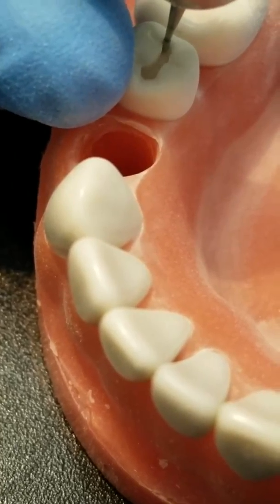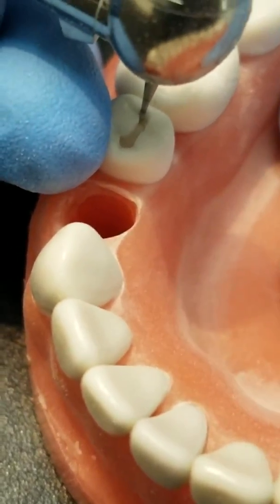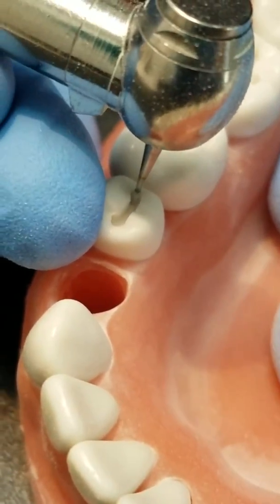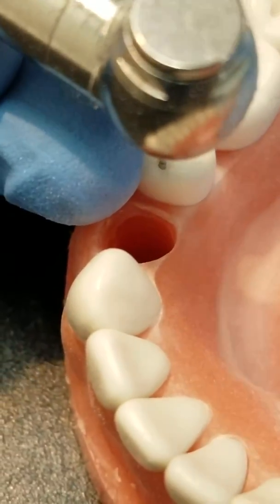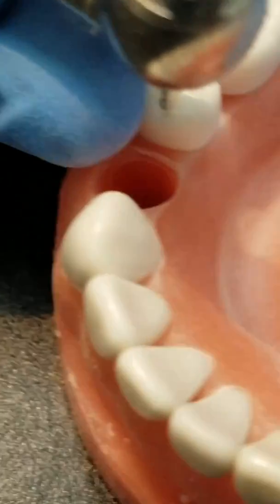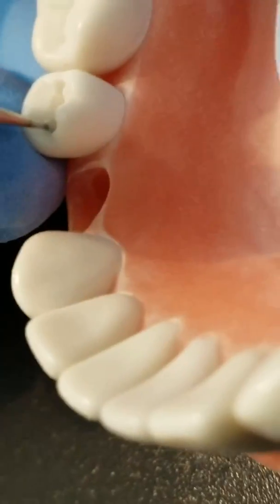You can hear me here testing the speed of the handpiece, trying to get it to slow down even more. Now I'm just finishing up all the walls, making sure everything is smooth and making sure that it's even.